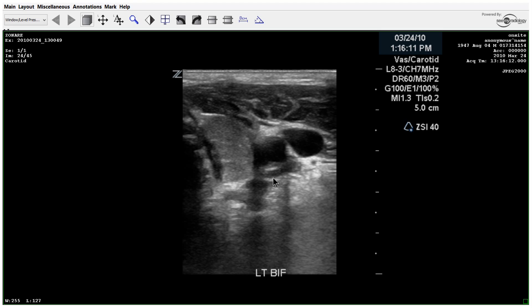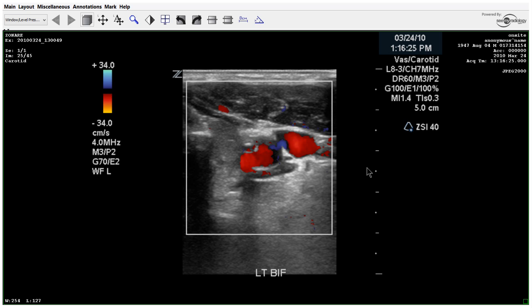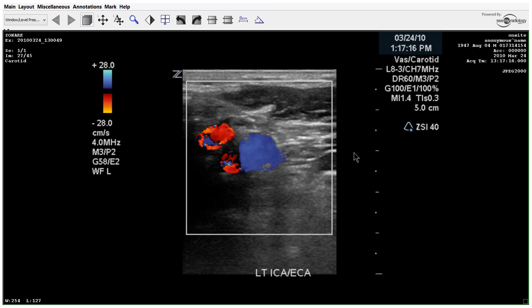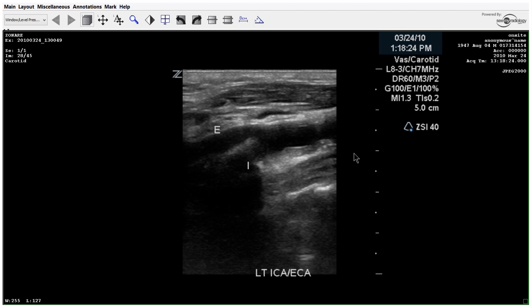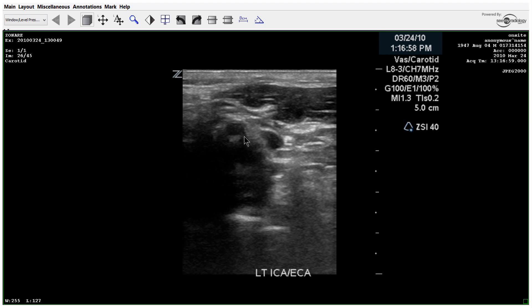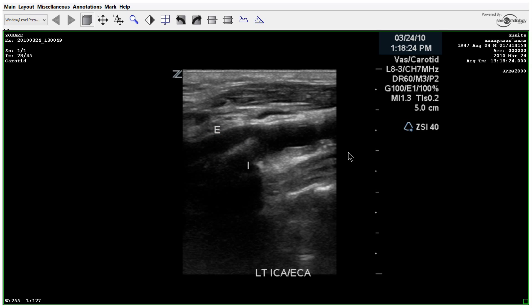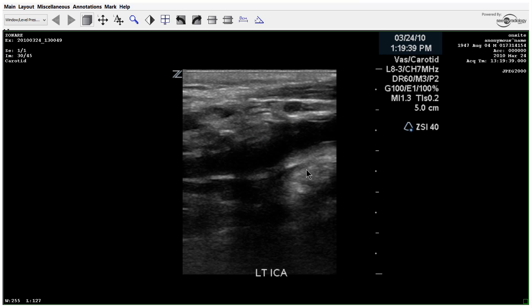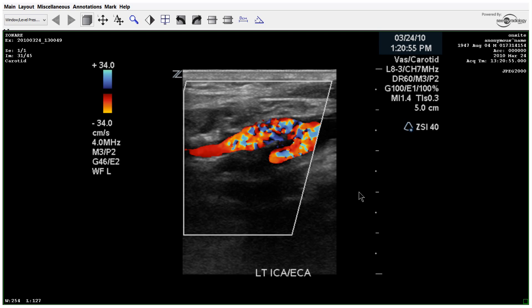Again we're seeing some plaque along the posterior wall. Here is the ICA, ECA, and color. At first glance this doesn't look like there's a lot of plaque or anything going on in the ICA — that looks pretty clean. However, when you turn the color on, there's an awful lot of aliasing happening.